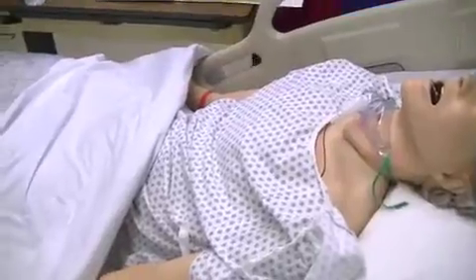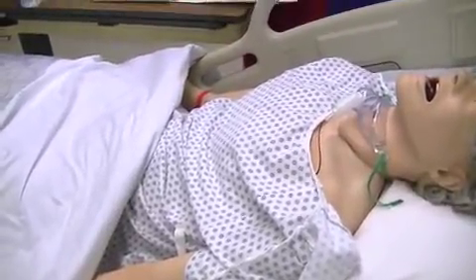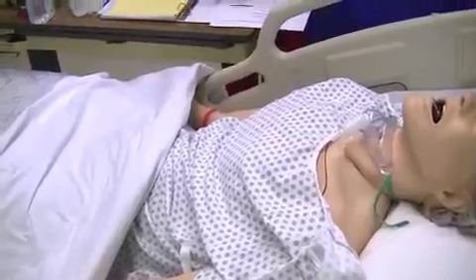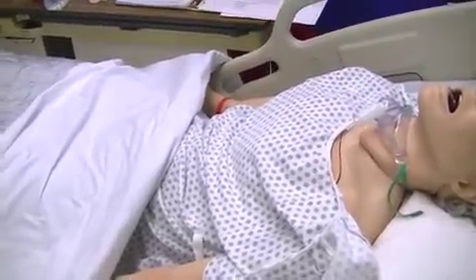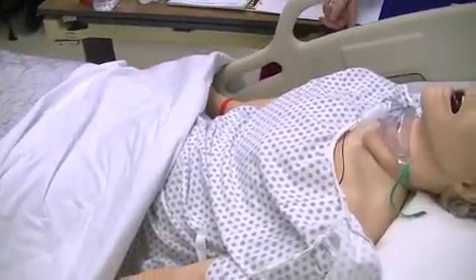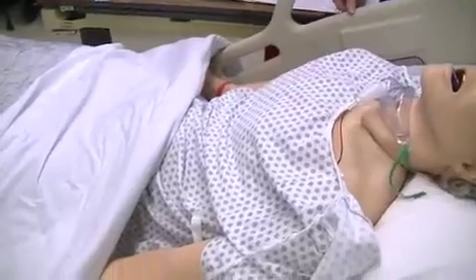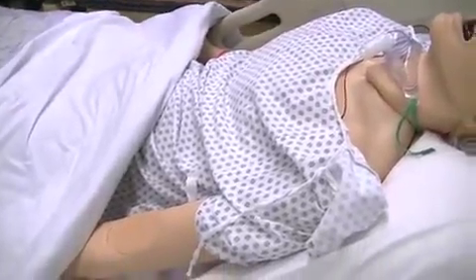Okay, Mr. Pierce. What we're going to do here is, your oxygen saturation was a little low, and you're supposed to keep it above 93%. So we're going to put oxygen on you. We need to make sure the bed is at working height. We only provide privacy if necessary, so pull the curtains if you're going to expose the patient.